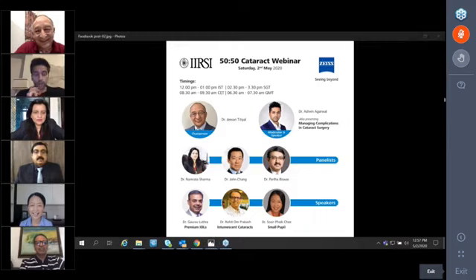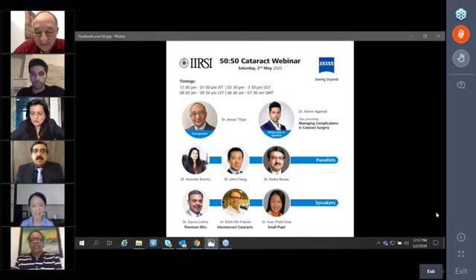One very interesting question, and I think I'll put that forward to Dr. Partha here. Dr. Partha, if you can answer: shallow chamber and small pupil. In these cases, what exact trick can we use because they are struggling with that situation? Remembering the fact that if it is a shallow chamber, the OVD is the first device that has to be used.